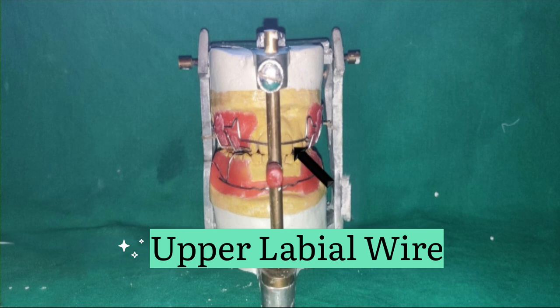The upper labial wire has a passive fit, lying in the middle of the labial surface of the anterior teeth. If active, it transmits the forces of the stretched retractor muscles onto the maxillary incisors, resulting in a change from Class 2 Division 1 to Class 2 Division 2 malocclusion.